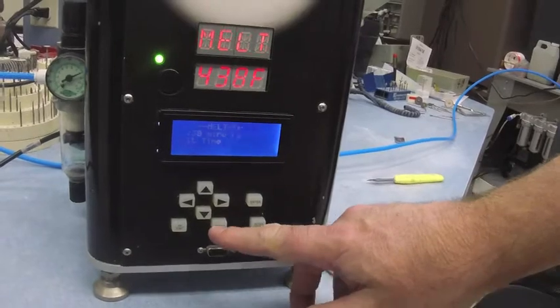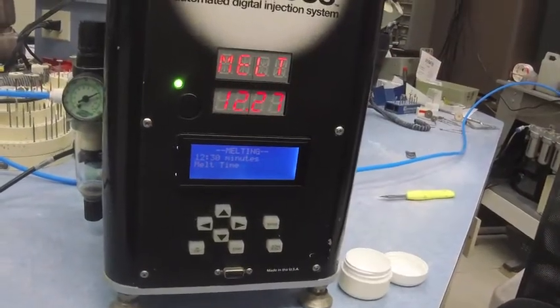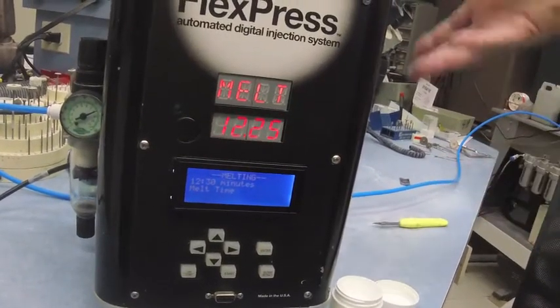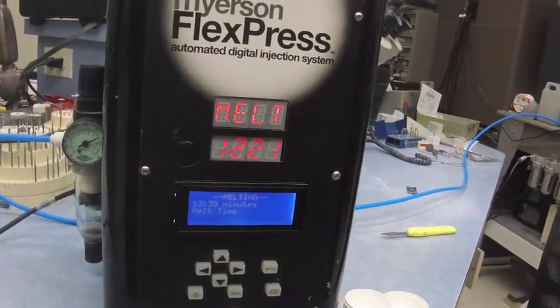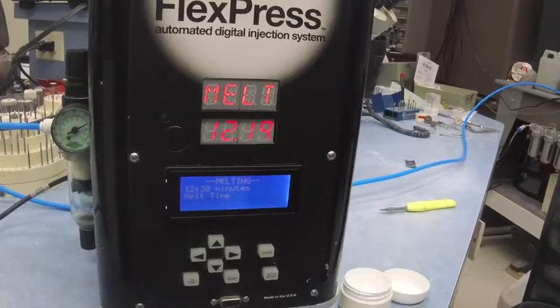We loaded the cartridge, we secured the flask, then we press start. When we hit start, it's going to start to count down. Once it counts down, it's going to inject, hold all on its own, and then beep at us when it's done.